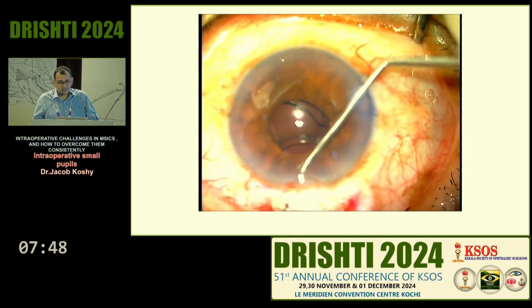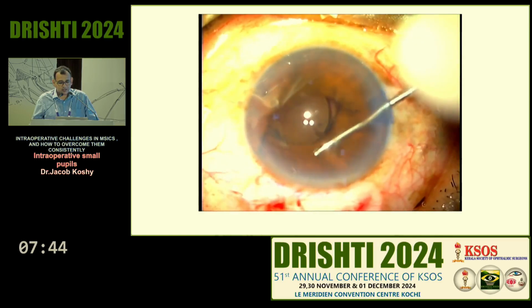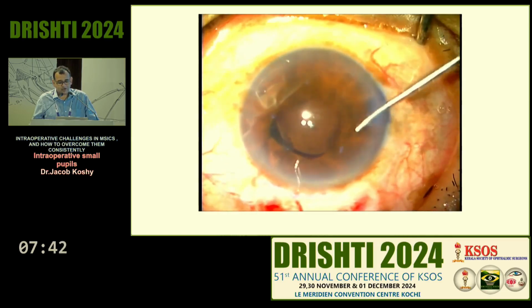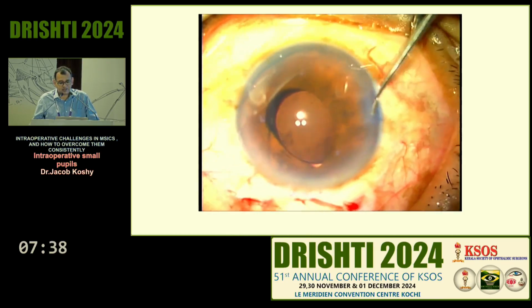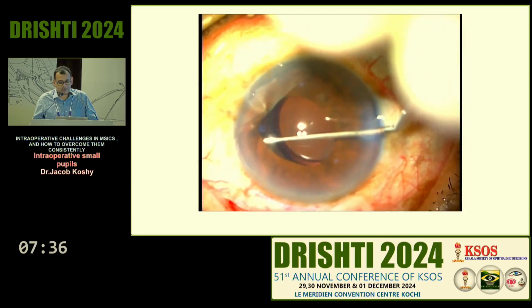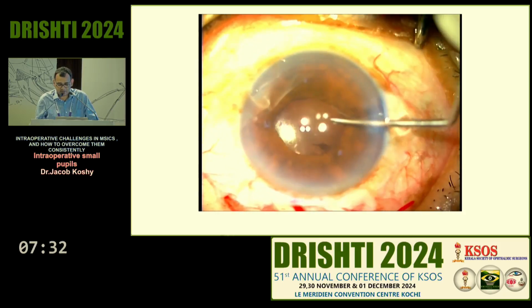Now, this patient had a foldable IOL, which is, anyway, I just pushed it back into the capsular bag. There was no vitreous, and the dialysis was maybe 2-3 clock hours. It wasn't causing much problem. Centration was good, so I left it there.